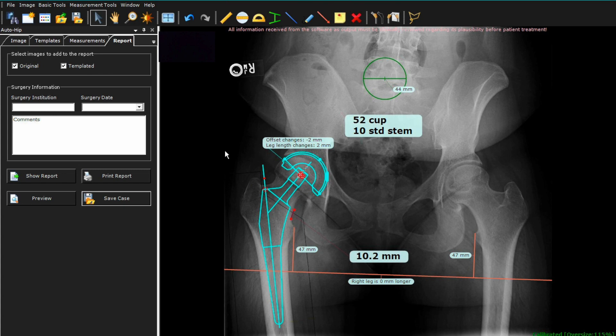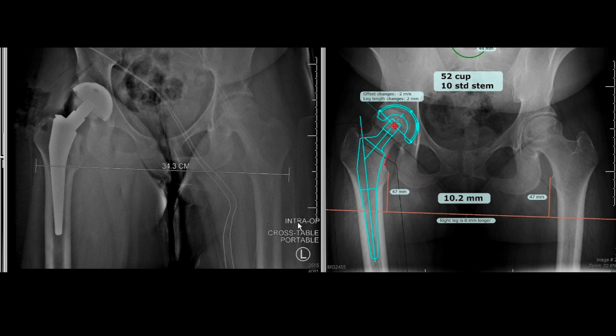Once that's done, you are ready to move on to another case. For this example, I'm now going to demonstrate how I utilize the templating intraoperatively to help position the implants. This shows the intraoperative X-ray on the left and our templating on the right. Earlier in the procedure, I utilized my template to make my neck cut at 10 millimeters and to see where this exits, which is in the piriformis fossa. At this point in the surgery, I've placed the final cup and have a broach in with a trial standard neck and a trial head and acetabular liner. We also previously measured the actual femoral head from the patient and checked this against the preoperative measurement to ensure our oversized calibration was correct.